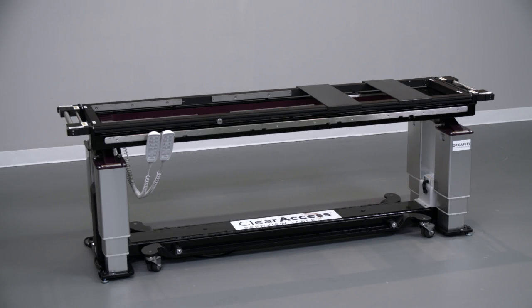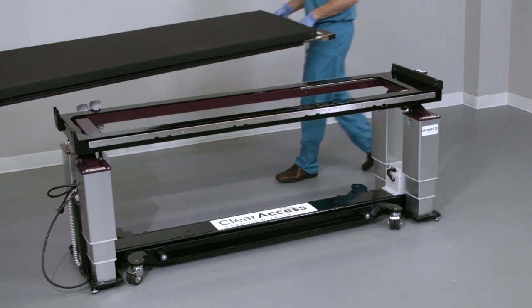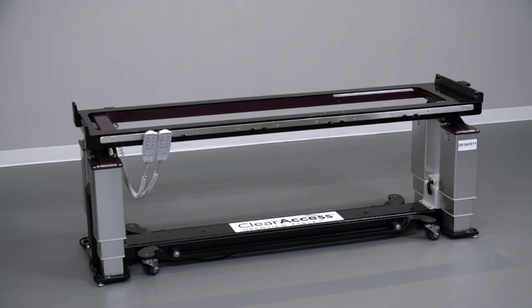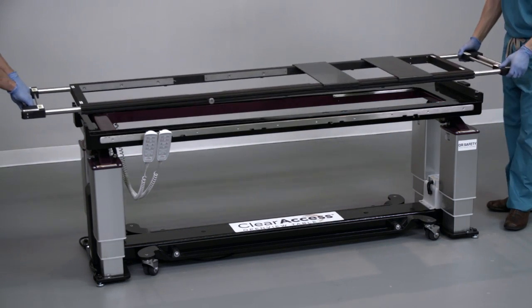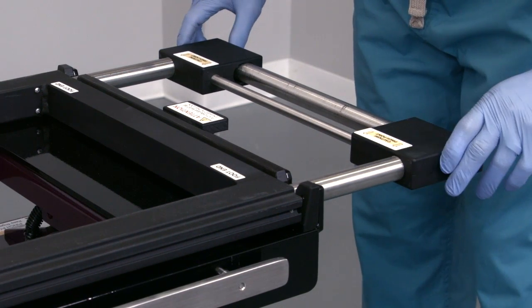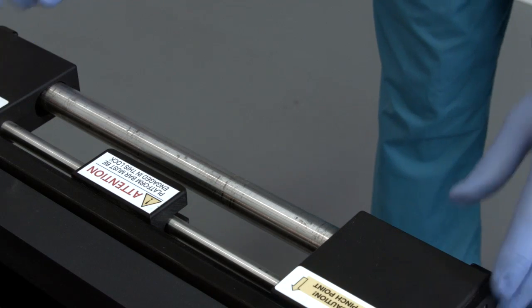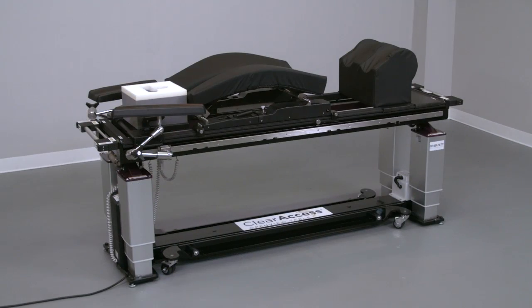If the prone platform is not already installed, it's likely that the supine platform, or flat top, is in place. If so, remove the supine platform by grasping the silver handles at both ends of the table. Extend the handles by pulling outward, then lift and remove the supine platform from the Clear Access table base. Next, install the prone platform, or open top, onto the table by bringing it over the table and lowering it carefully into the cradle. Once completely seated, depress both thumb releases at each end to collapse the handles into the platform. Collapsing the handles at the foot end locks the prone platform into the base.